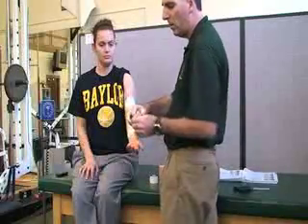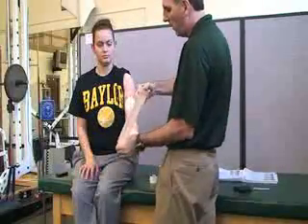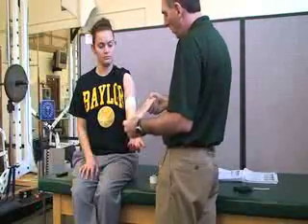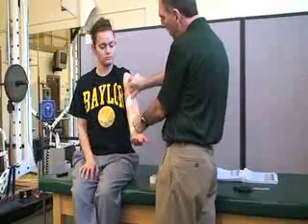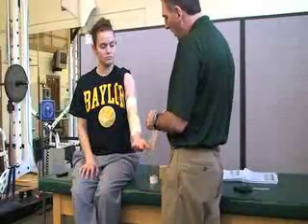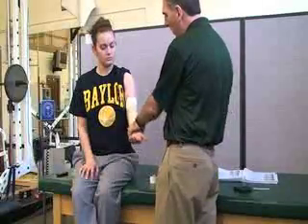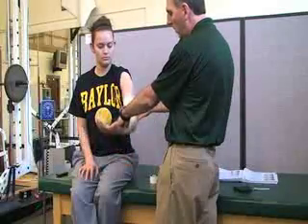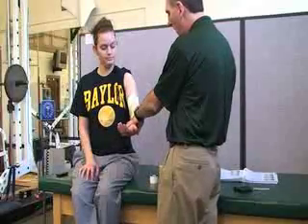Then we're going to apply an X pattern. I'm going to use Elasticon tape or something strong that doesn't have much give. This can be done a couple of different ways — you can do this directly on the person. What you want to do is make sure you find the point of pain, go to that point, and back off a little bit. That's where you want to tape it.